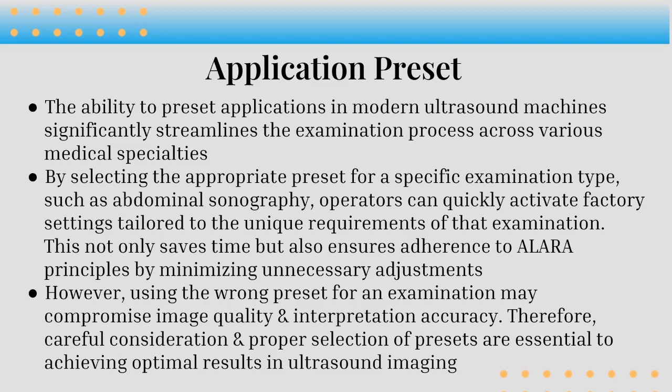This not only saves time, but also ensures adherence to ALARA, which means as low as reasonably achievable. It is an ultrasound physics term that everybody who performs ultrasound should abide by. It minimizes unnecessary adjustments when selecting the proper application preset. However, using the wrong preset for an examination may compromise image quality and interpretation accuracy. Therefore, careful consideration and proper selection of presets are essential to achieving optimal results in ultrasound imaging.